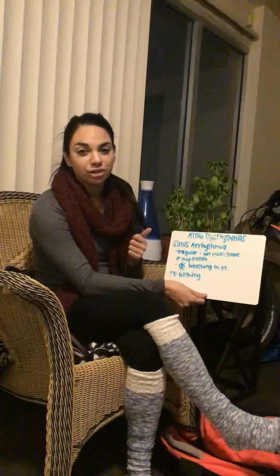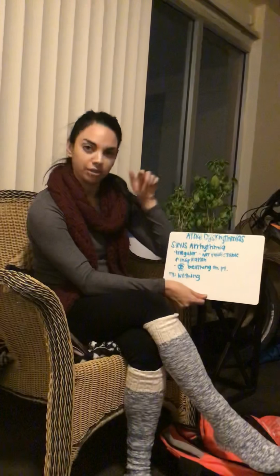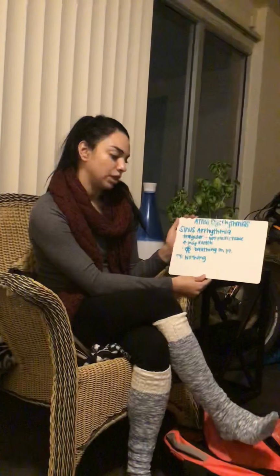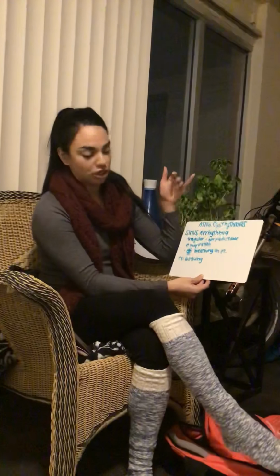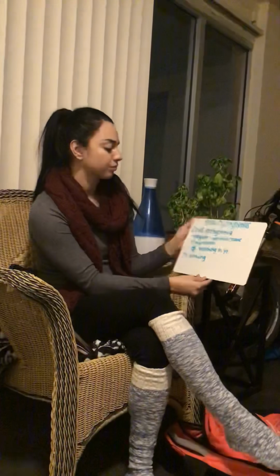So with inspiration, you're going to find that the heart rate speeds up. So on an EKG, you'll find that that rate is quicker, then it'll slow down, then it'll be quicker, then it'll slow down. And the biggest thing as far as diagnosing this is just to watch your patient breathe and observe that while also observing the EKG. With this, it's not harmful, so no treatments needed.